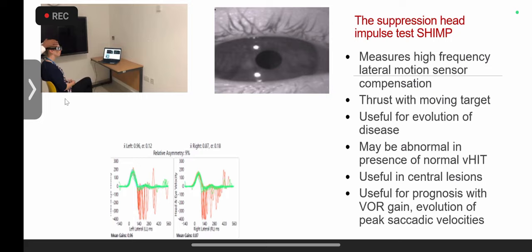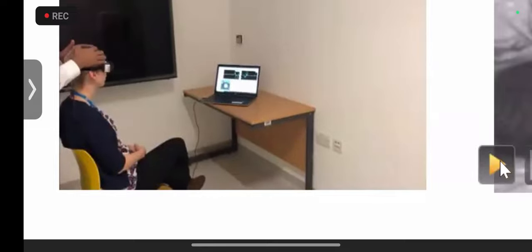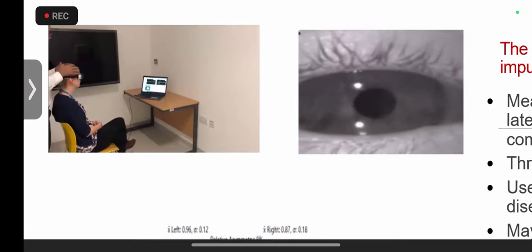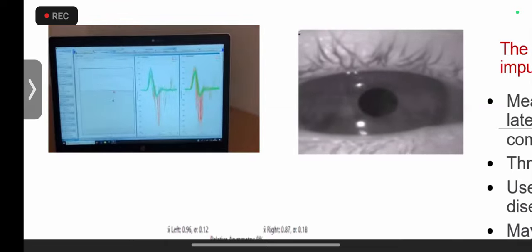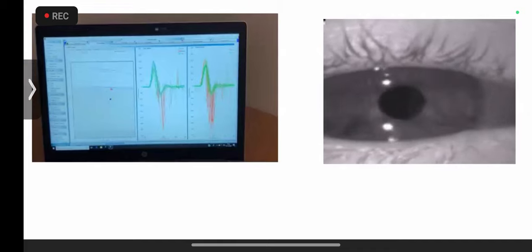The SHIMP protocol differs from the HIMP: last time the target was fixed, but here the target moves. The subject — my resident — tracks the moving target, and because you're overriding your VOR, you get what we call an anti-compensatory saccade where the eye moves towards the direction of head movement. The SHIMP VOR gain is probably a better indicator than the HIMP VOR gain because covert saccades influence the HIMP gain, whereas in SHIMP — called the covert saccade killer — you get hardly any covert saccades.